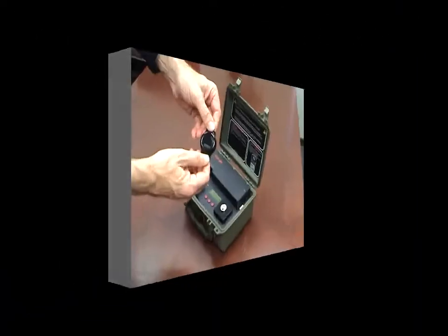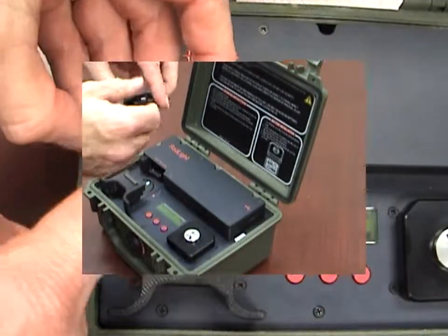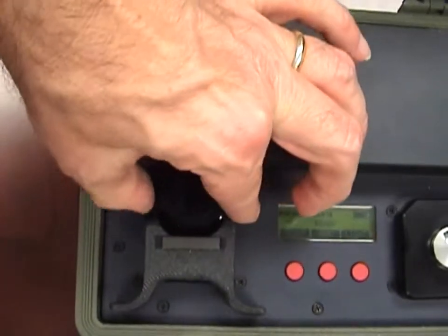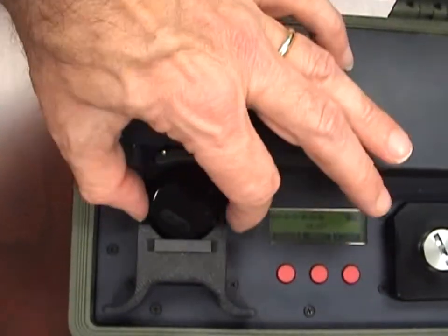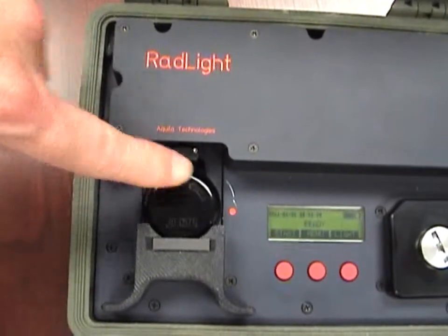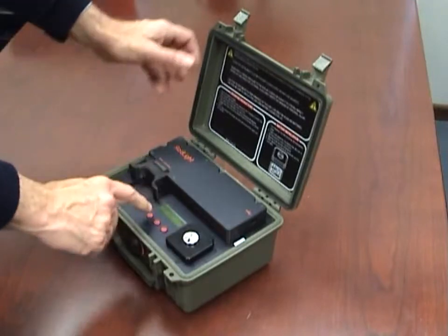To insert the RadWatch dosimeter into the RadLite reader, align the grooves on the bottom of the dosimeter with the ridges on the reader drawer. Twist the dosimeter in the direction of the arrow until the ends snap into place. This action disengages the RadWatch cap from its base. Close the drawer and press the start button.